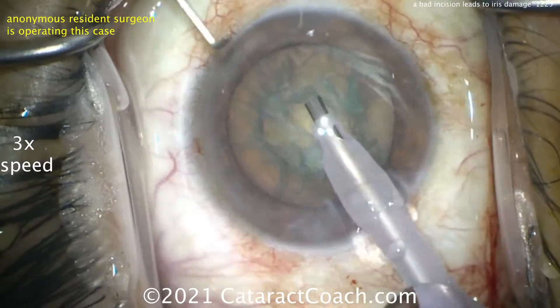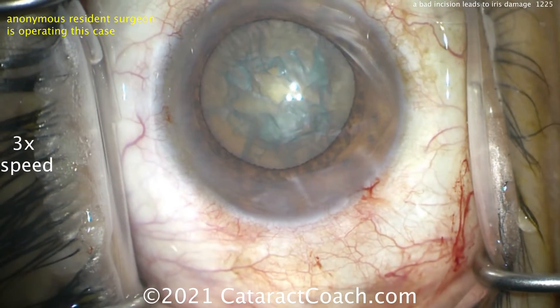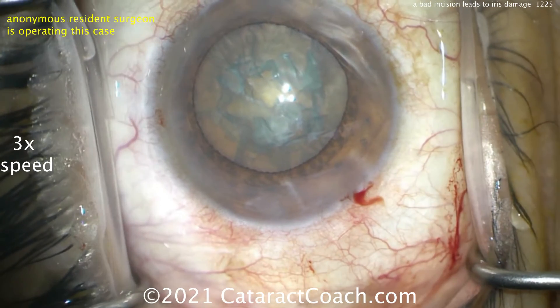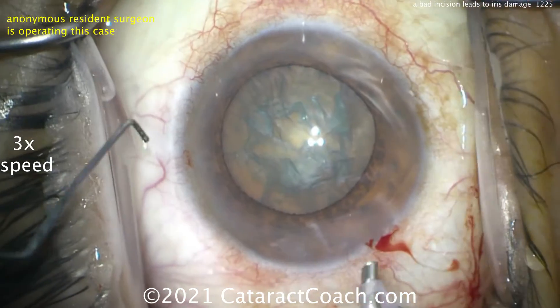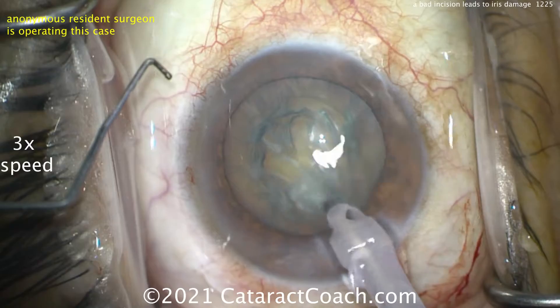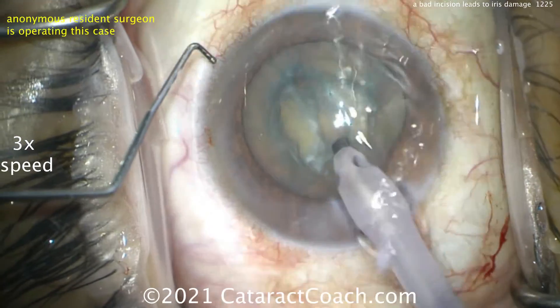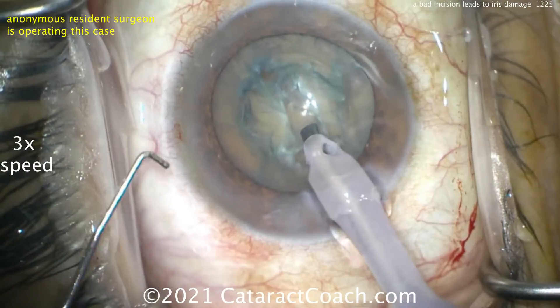Look at the main incision — how much extra fluid is leaking out? That's a tremendous amount of fluid leakage; you don't want that. Now look at it — when he came out of the eye with the keratome sawing to the right, it widened up so much. Look at the phaco tip as it goes in — lots of fluid leakage.